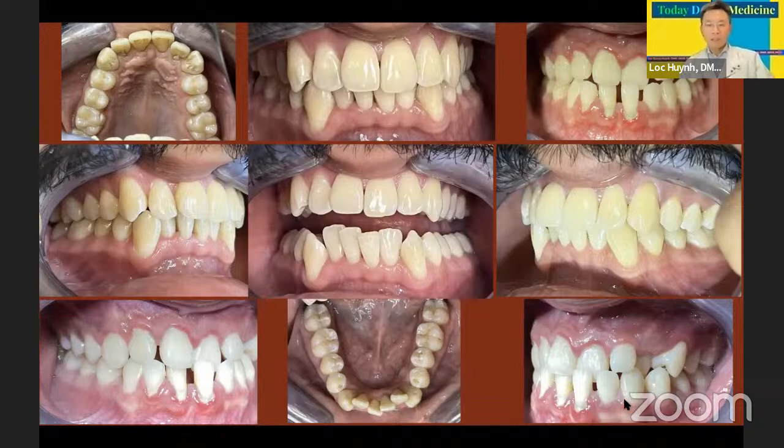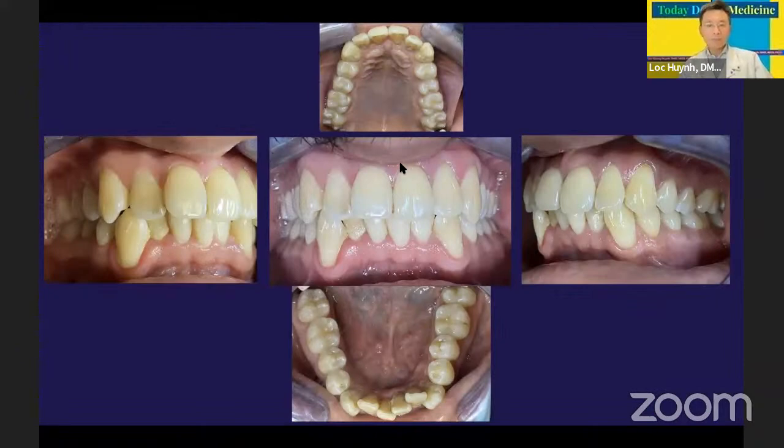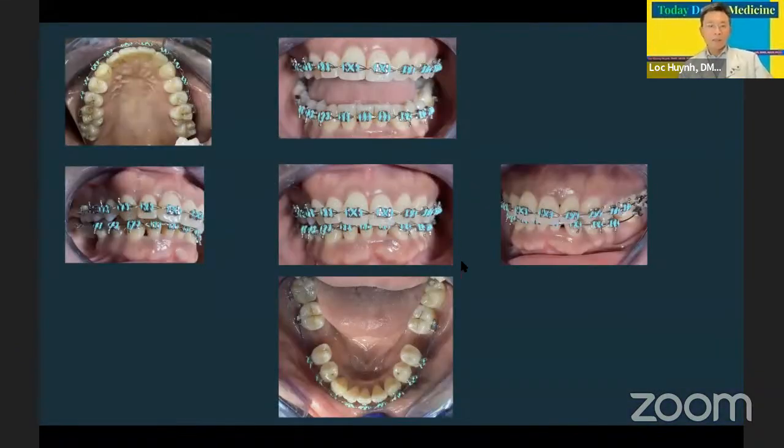Here is a picture I would say is acceptable. You can see the gum bleeding and all of that. Some of these are good, some of these are bad. Like this one is not good. Not good, not good, on the first, third, on the middle line here. Not good here, guys.